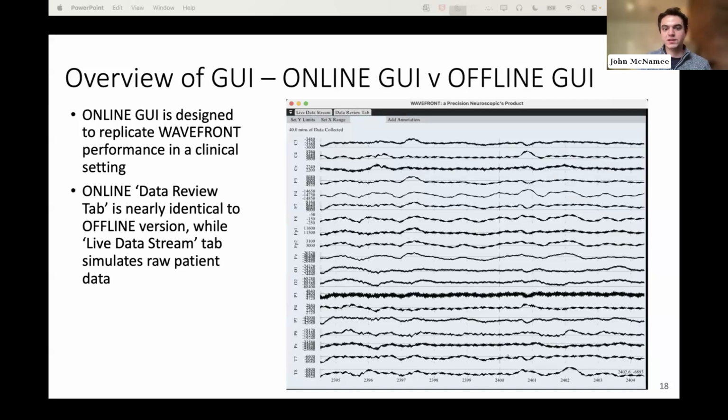This front end is also connected to a series of data queues and data storage and processing blocks. As data flows through the GUI, it sits in those queues, and as a critical amount of data is collected, those queues then send the data through the processing blocks when appropriate. This allows us to start developing the code we need to simulate data flows and other things of that nature, to prepare for integrating with an amplifier and connecting to the real-time processing that we will eventually need for a clinical setting.